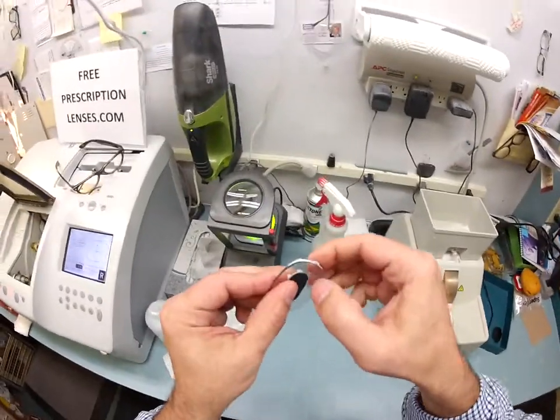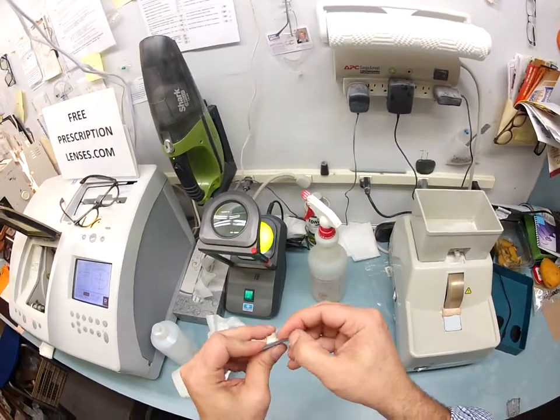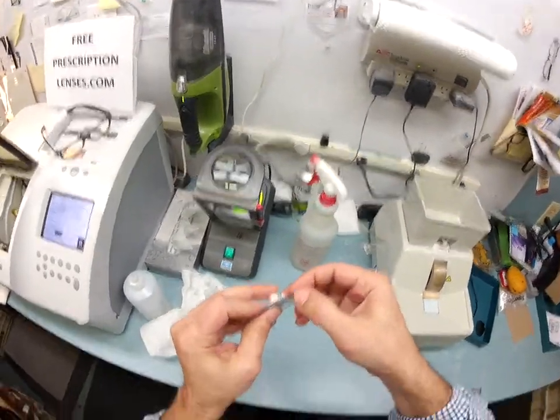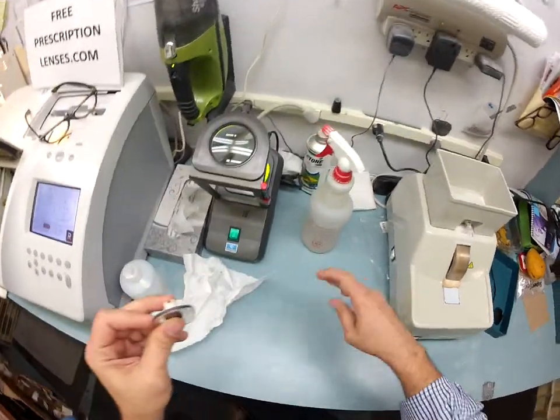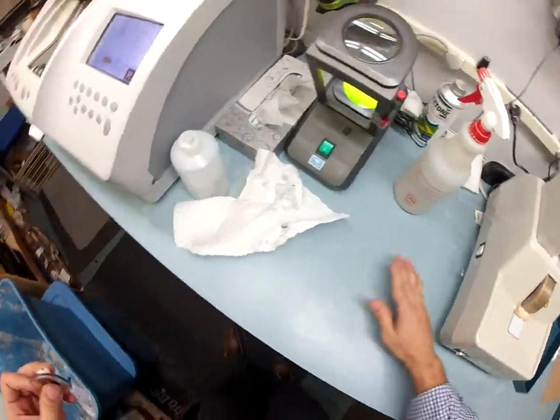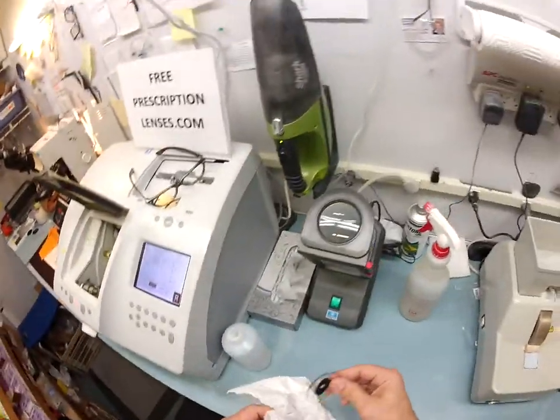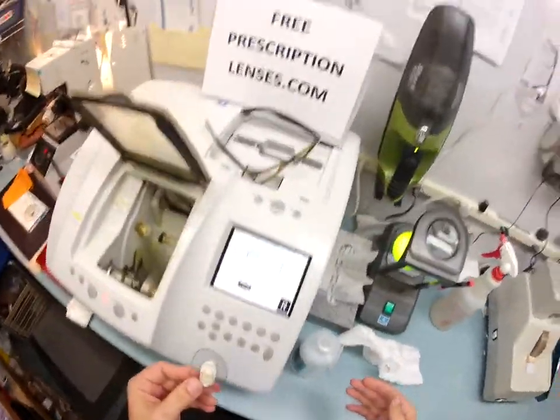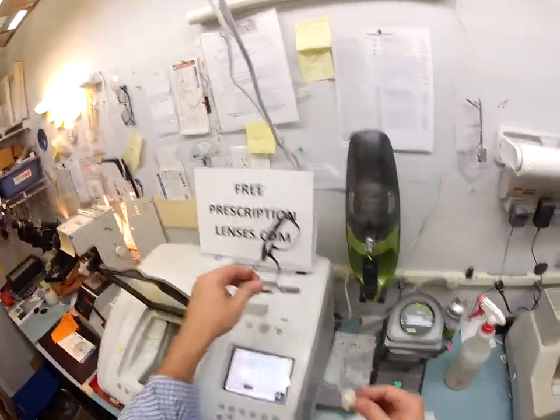I take off the rough edges, and if you can see this little white powdery substance, there's lots of it down in Colombia, should you happen to go down there. But I scrape it off the edge of your lens, and it falls onto the counter. Once it's onto the counter, I gather it, making sure not to lose any of it, and then I wipe it onto the floor. And this is the part where I remind all the kids, kids, I went to school for years to learn how to wipe stuff on the floor. Don't think you can do it as easily as me. Stay in school and learn how to make a mess.